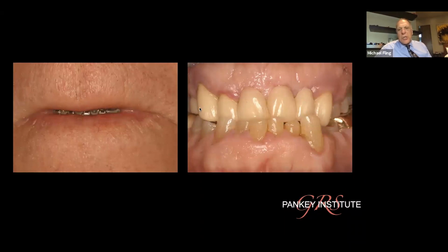In addition to that, he's got heavy dental alveolar extrusion. We're going to do orthodontic intrusion. And in addition to that, we're going to open vertical dimension. The dilemma is, if I'm opening vertical dimension, I am committed to restoring at least one full arch. So if I'm doing that, in his case, I'm committed to full arch, crown, and bridge. Well, that's a lot of money.